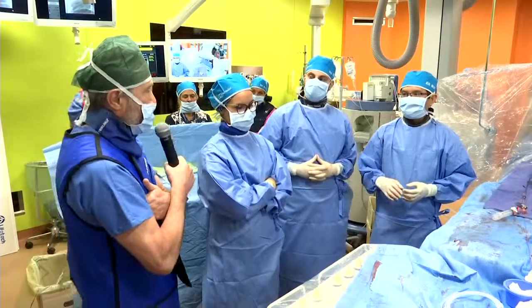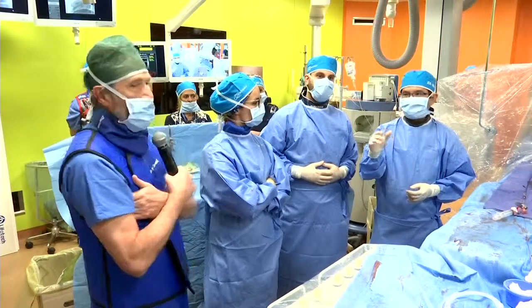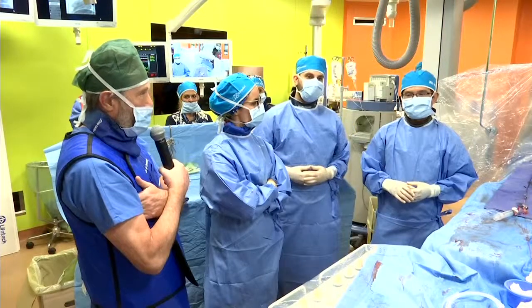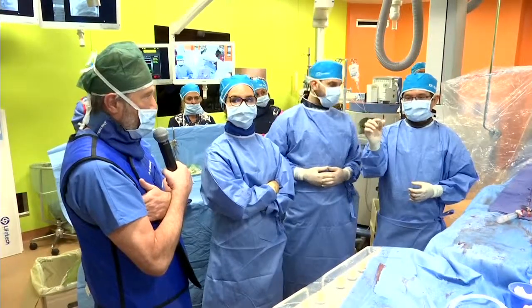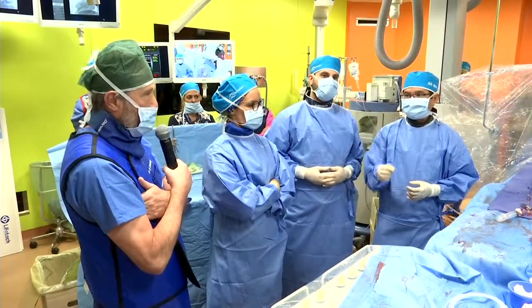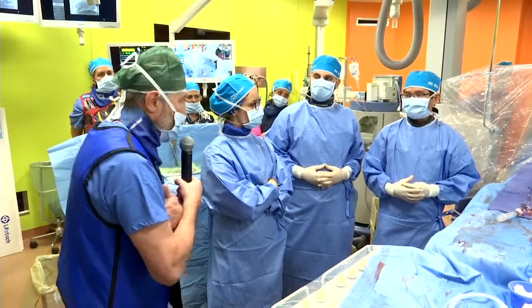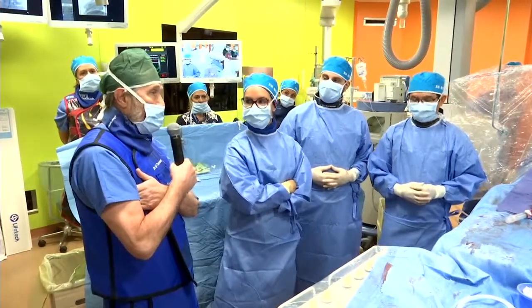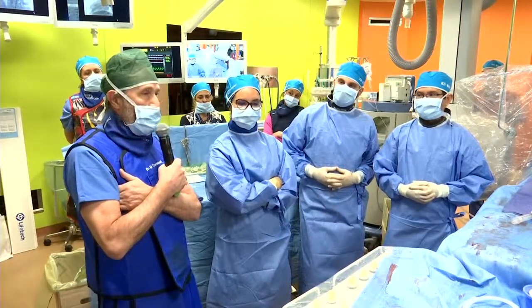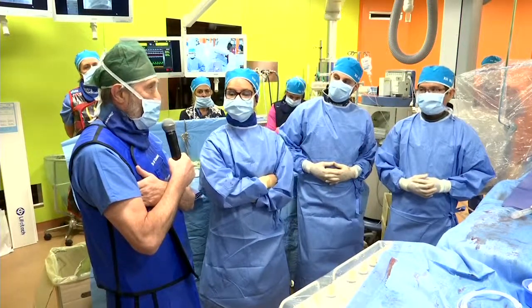Yeah. Tin, last final comment from you. I think 18 months is a very small baby. We don't try to close the defect in a very small baby. That's right, because the LVOT, RVOT, and AV node, the conduction system, are very close to the defect, and we don't try to close very small babies. Yeah, that's right. In fact, when we published our European registry many years ago, the most important risk factor for heart block was the age of the patient.